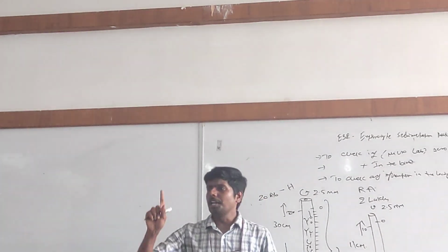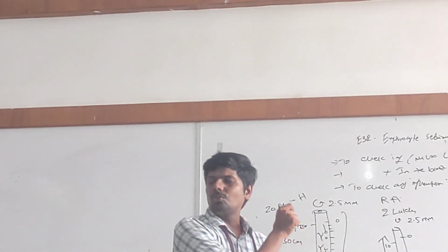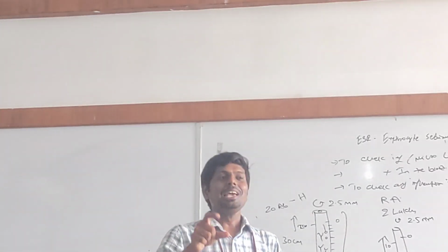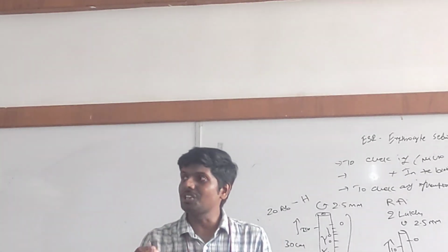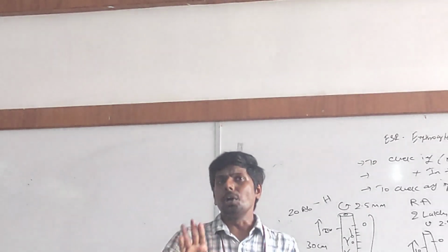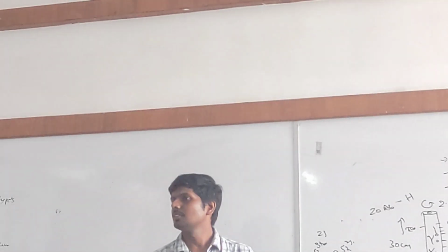Now listen, there is one problem with EDTA. When we are adding EDTA to the blood, the blood becomes thin. It's losing its viscosity. Actually, we need its viscosity to study the sedimentation. So EDTA sample is not the right sample for performing ESR.